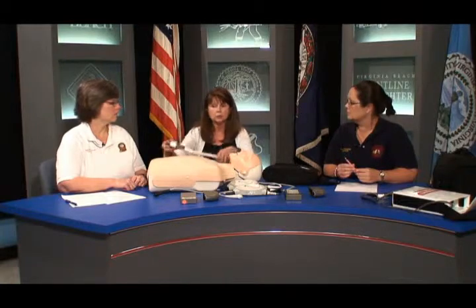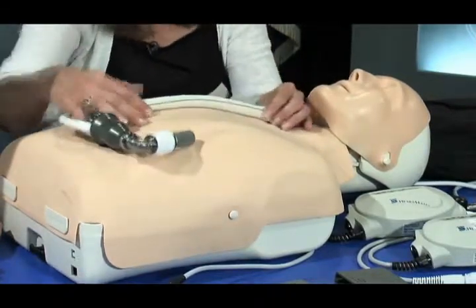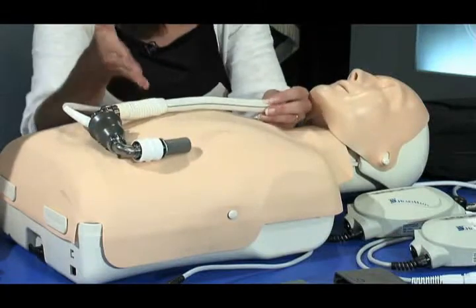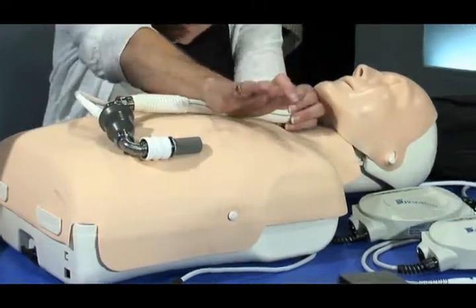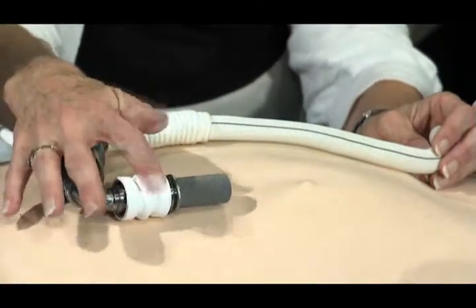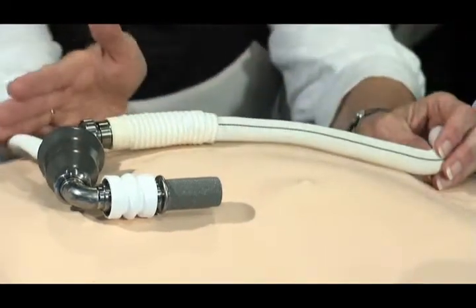In your mind's eye you have to remember where the pump is situated — bottom part of the left ventricle, with a pocket here, and the cannula under the sternum. This cannula is not steel — it actually feels like tissue paper and is very fragile. You don't want to dislodge the cannula. So you go off and upward, staying away from the pump area — just off center of the sternum, slightly to the patient's left.